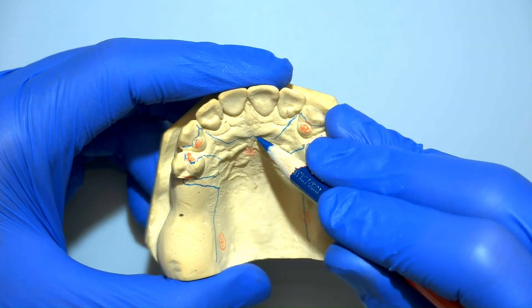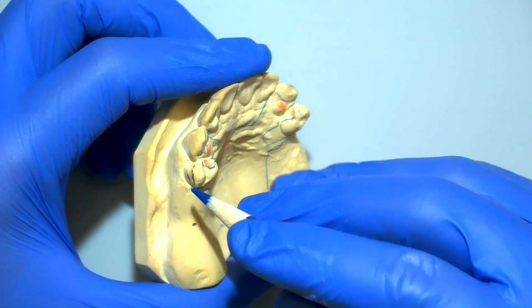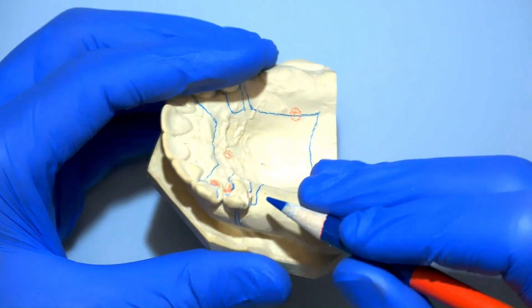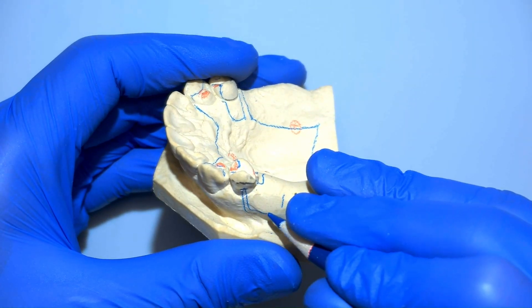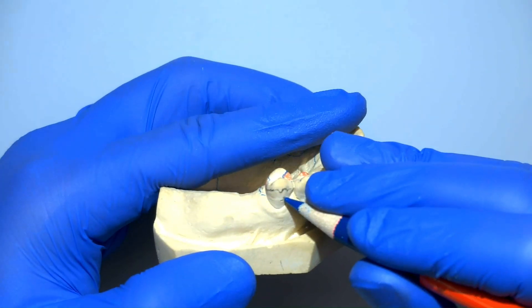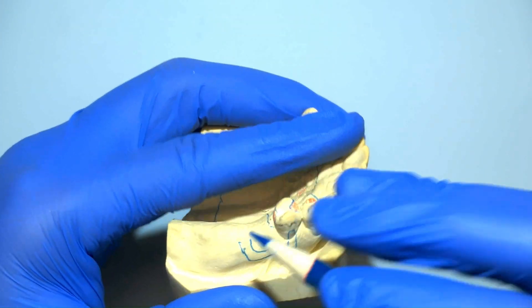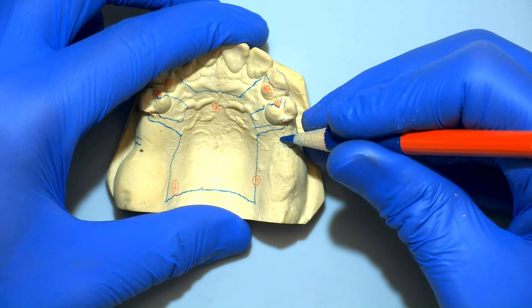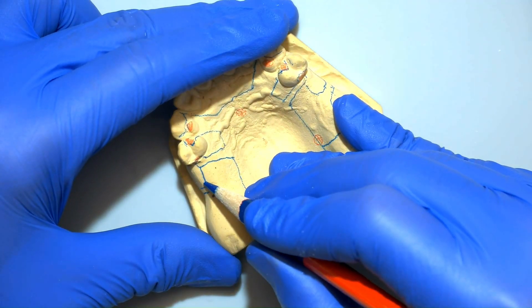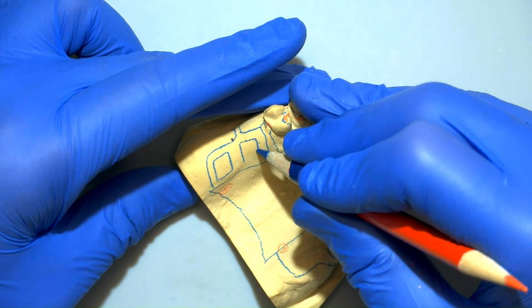Then we'll go ahead and connect all the different edges of the minor connectors to finish off the shape of our major connector. Now that we have a better idea of how everything is going to look, we're going to draw the I-bar clasps. The tip is drawn at the undercut, then we visualize skipping one tooth space and draw the origin of the I-bar clasp, then connect the tip with the origin to finish off the shape of the clasp. To finish the lattice, we connect the anterior edge of the origin to the guide plane and the posterior edge to the back end of the major connector, leaving a little space for the finish line to blend with the denture base. Then we add holes over each tooth to finish the shape of the lattice.